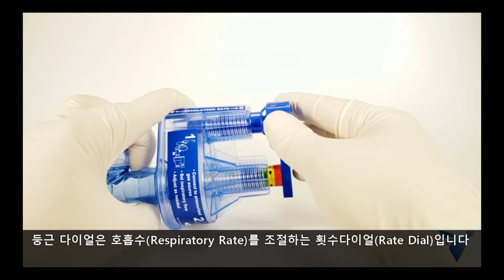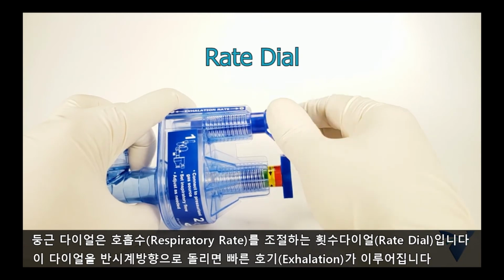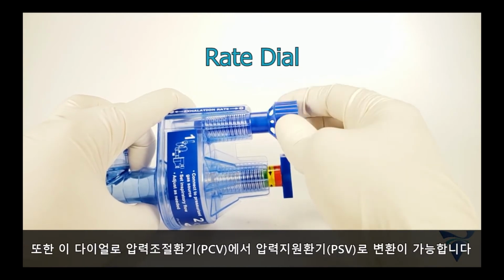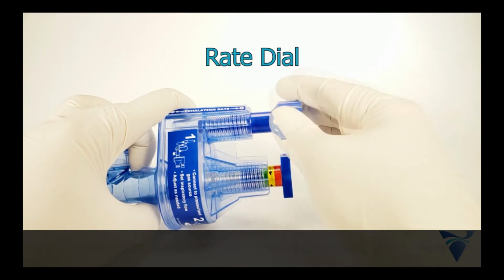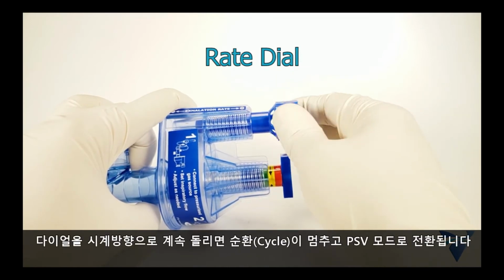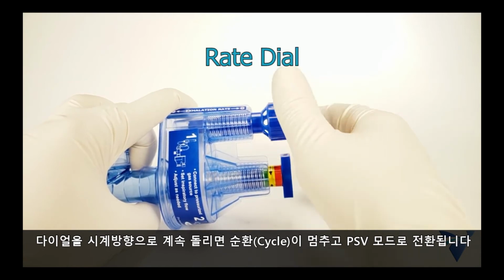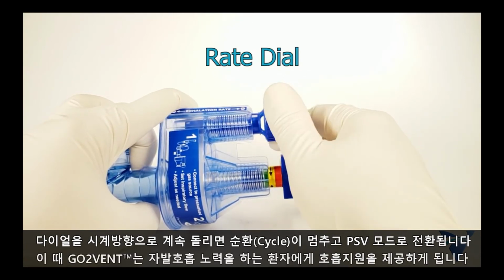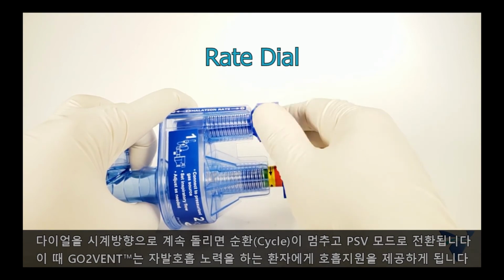The round knob is the rate dial, which controls the respiratory rate of the patient. The dial is turned counterclockwise for quicker exhalation. This dial is also used to switch from pressure control mode to pressure support mode. When the rate dial is turned clockwise just until the device stops cycling, the device is in pressure support mode. The GO2VENT will now provide breathing assistance to patients who are able to exert some spontaneous breathing effort.